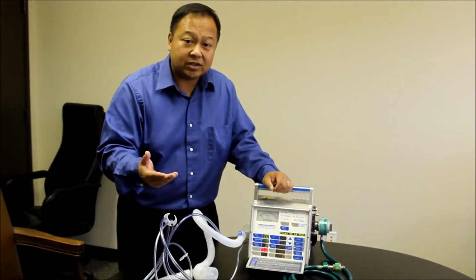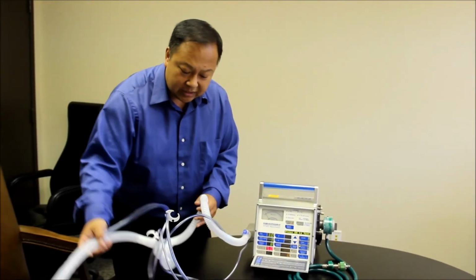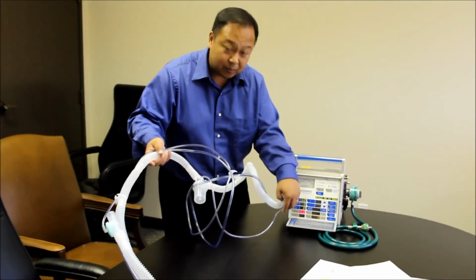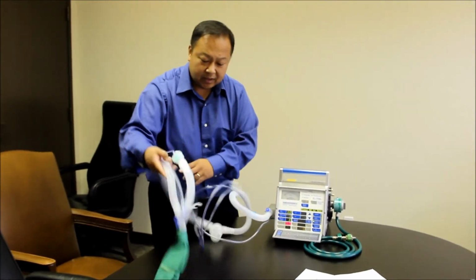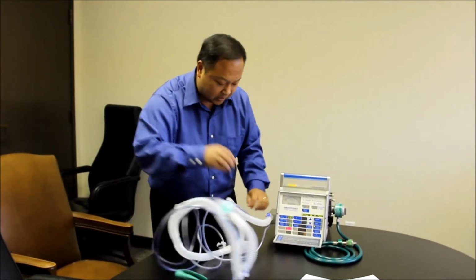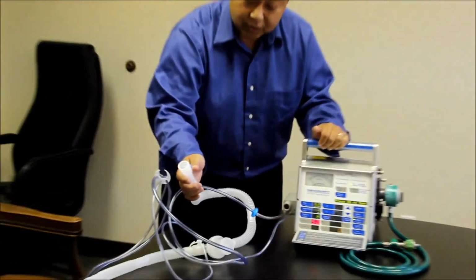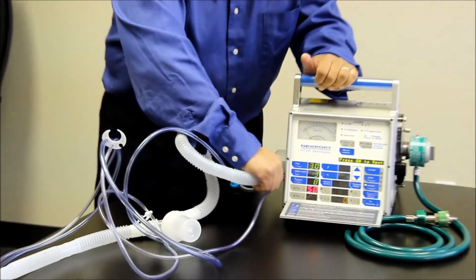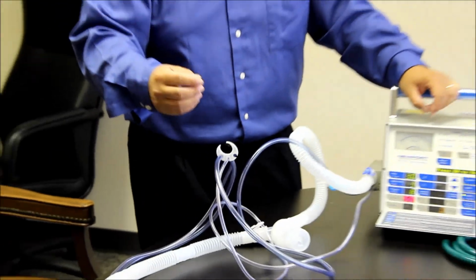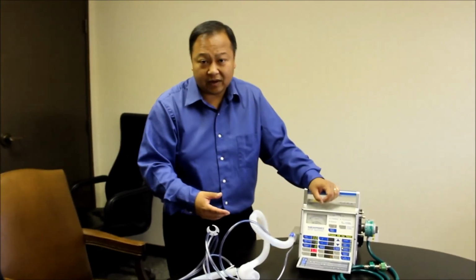The other thing that can cause a low pressure alarm is, like I said, a leak or a disconnect in the system. As you can see, this basic ventilator has so many connections that can be dislocated. It could be dislocated at the Y right here, or right here at the inspiratory port, and anywhere along this tubing it can be disconnected. So if you have a low pressure alarm, that typically means there's something disconnected, and you have to find out the reason.